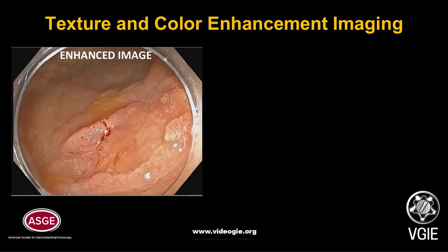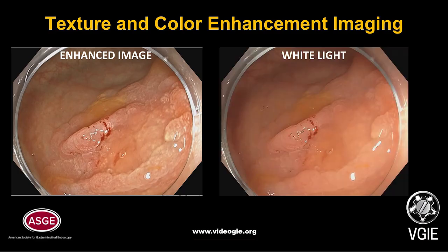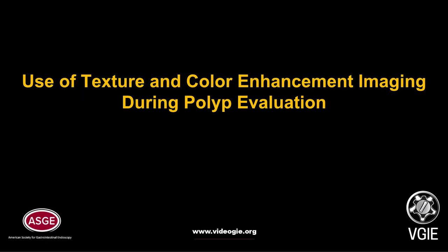In this case, the enhanced image provides more detailed information about the lesion margins and surface pattern, which is particularly more evident on a side-to-side comparison with the original white light image. In the following section, we demonstrate the use of this technology to enhance optical assessment and lesion characterization.